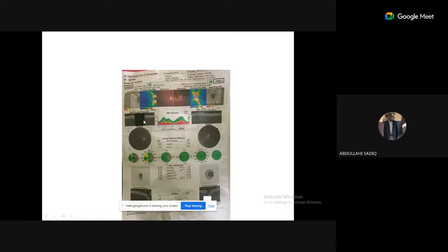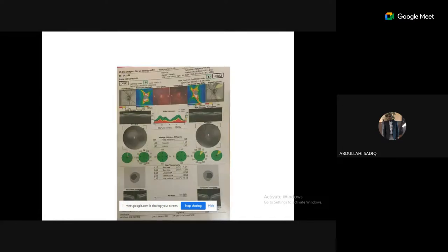But this one is also a result of motion artifact and blinking artifact. And you can see this one is also another form of decentration. And therefore, look at these results. Look at the others, everything looks normal. But this one now cannot be relied on. So we repeated this result, and this is how it comes out. This is the same patient when we repeated it, and this is how it becomes. So everything now becomes normal.